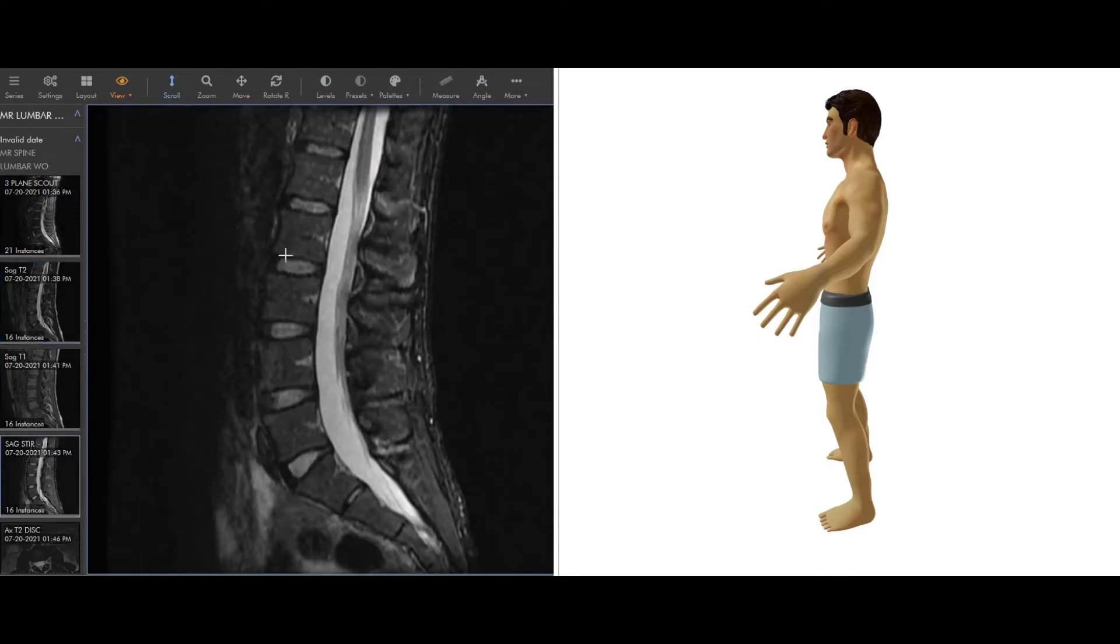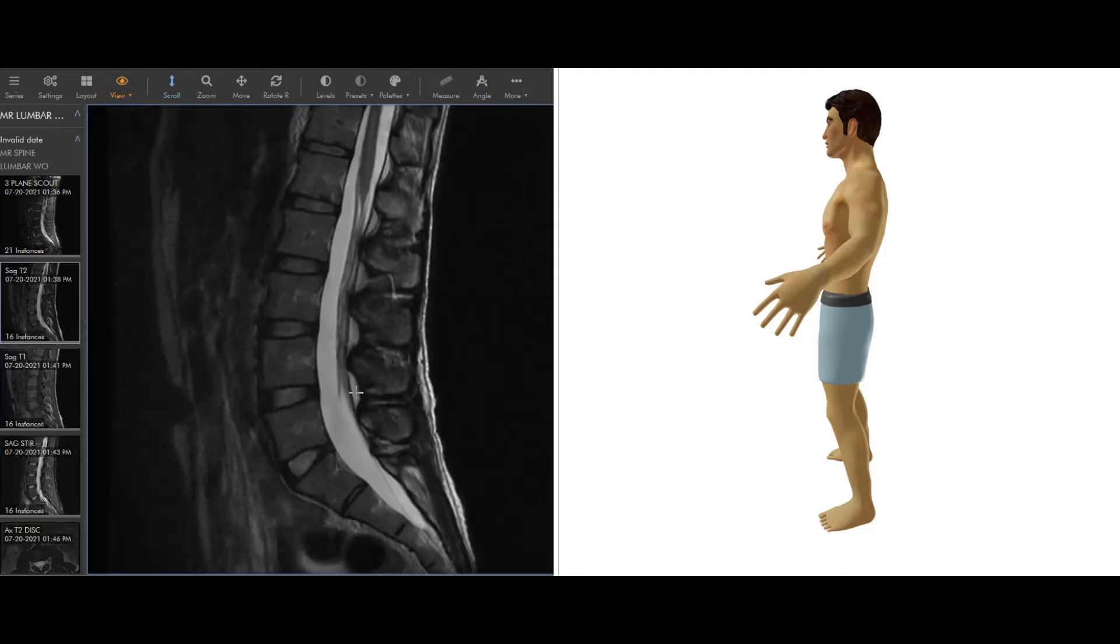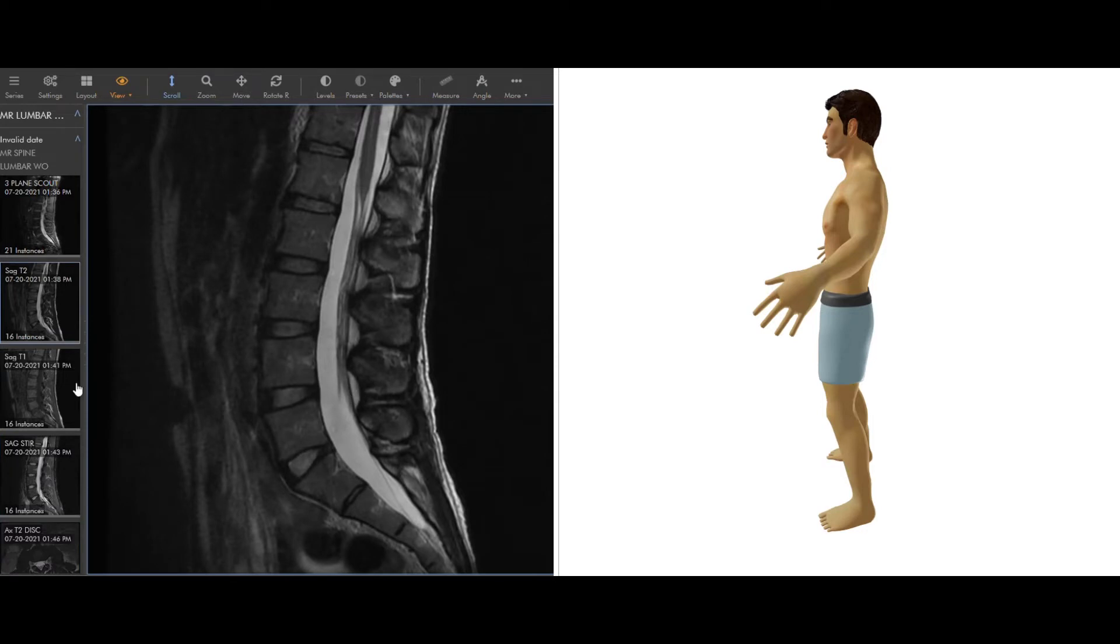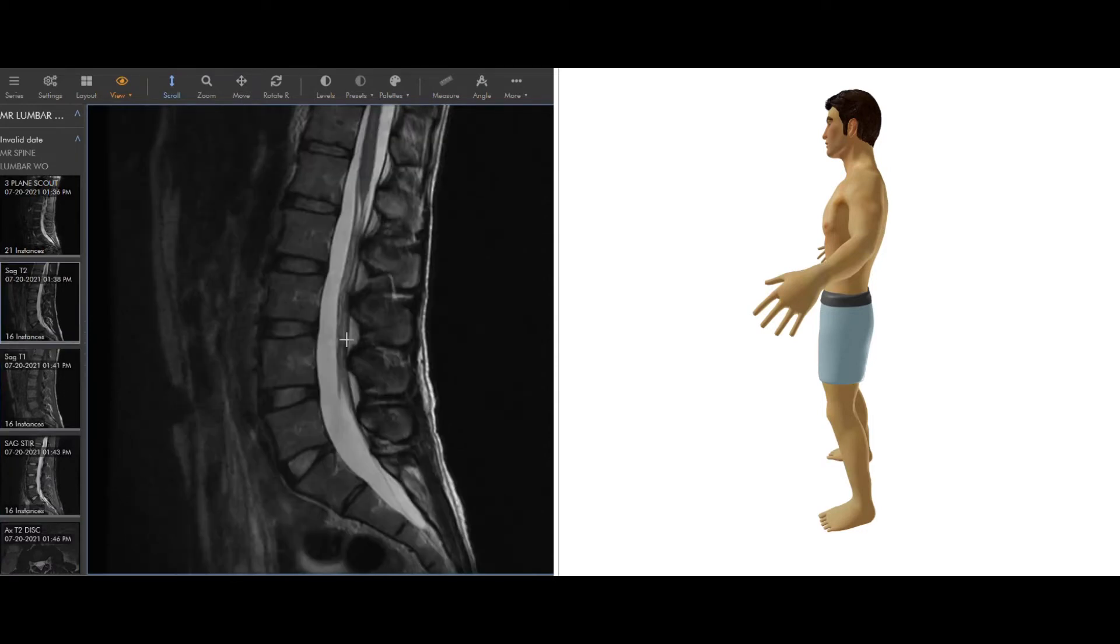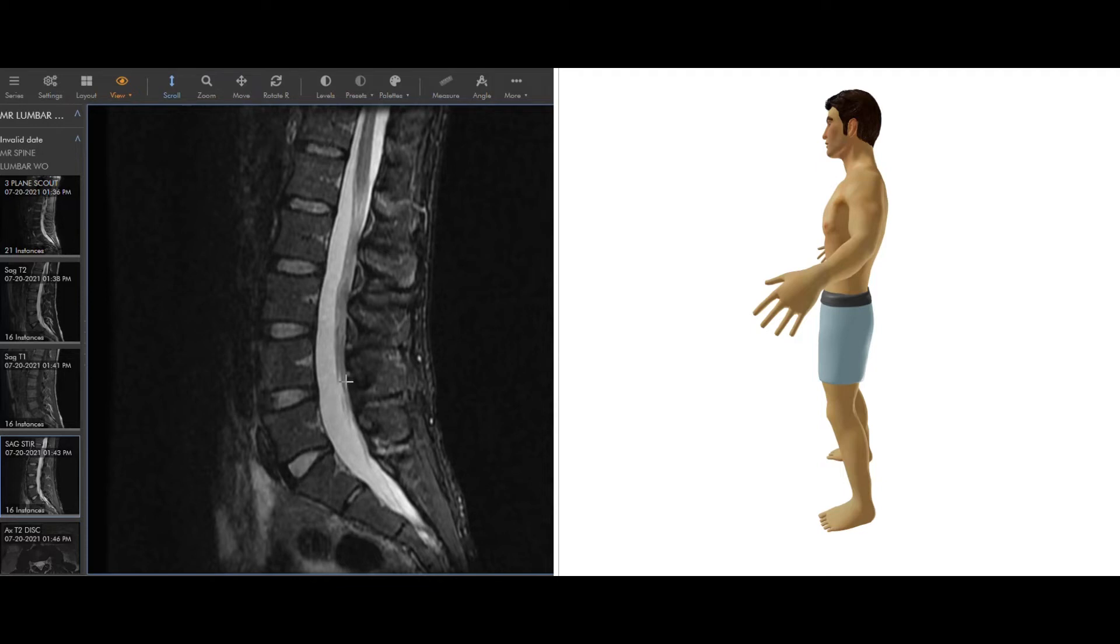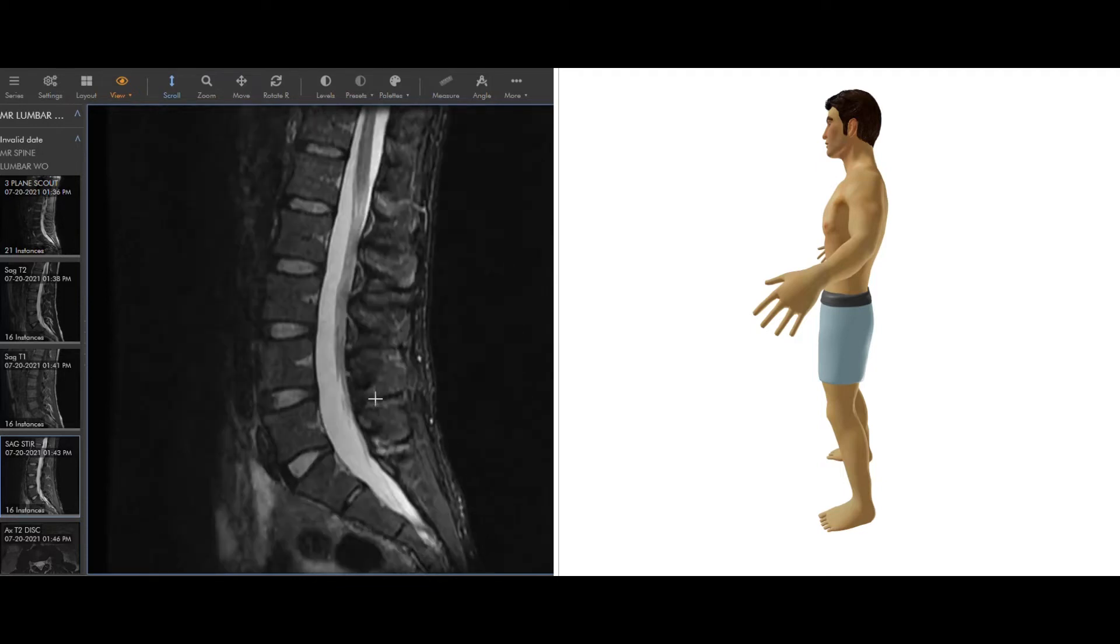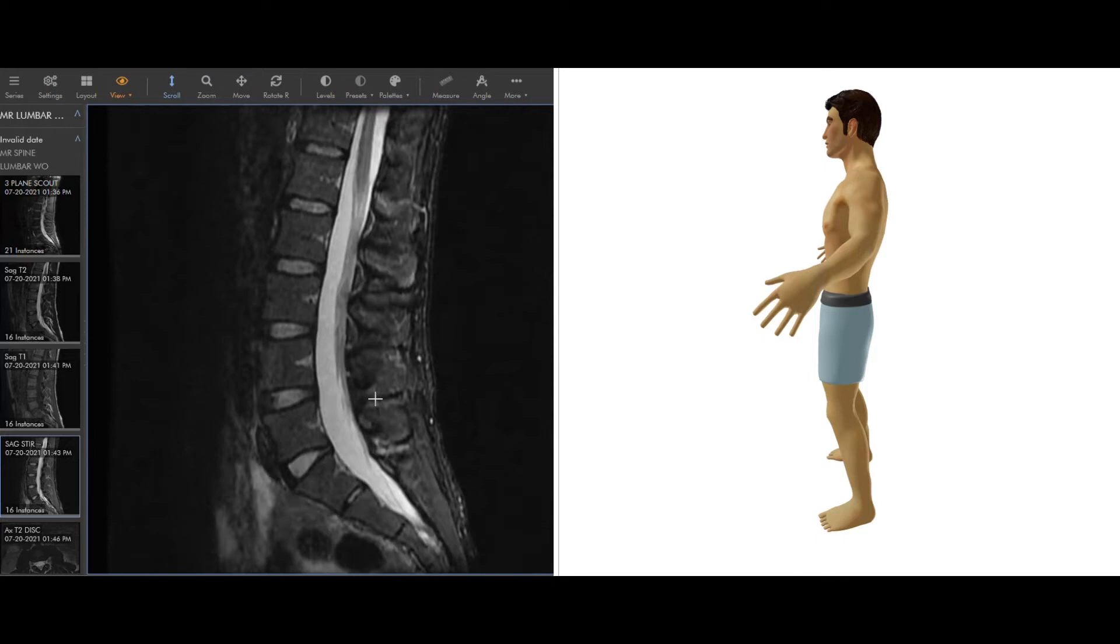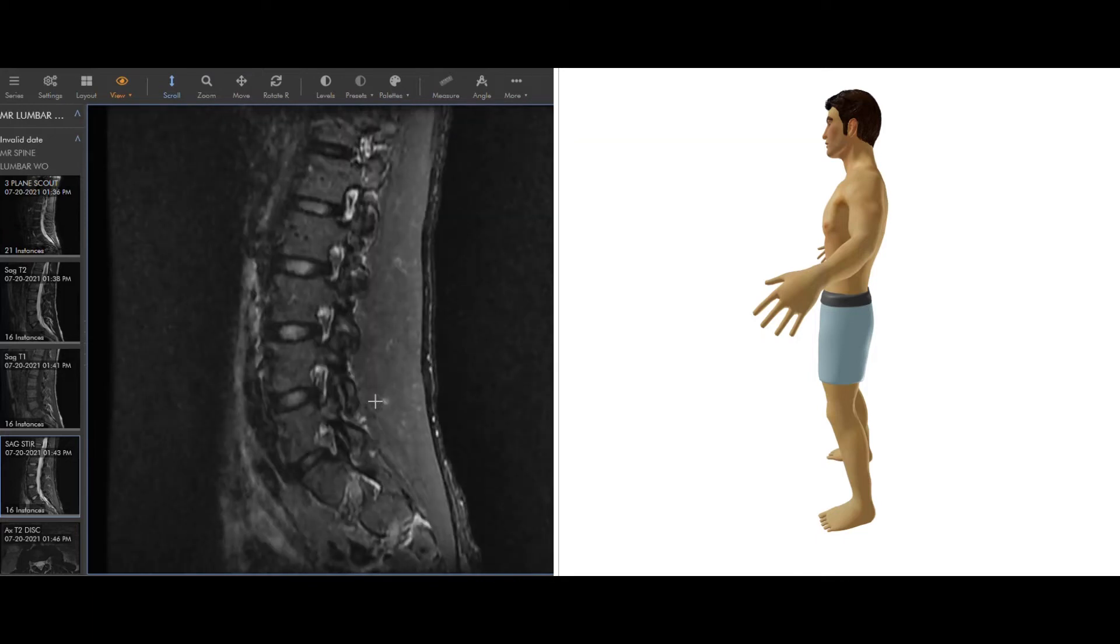This sequence here, this is called a STIR. It's not really important what it stands for, but basically it's a sequence that makes fat black. Back to this T2, you can see the fat is white here too, just like on the T1. So if we want to distinguish when something is not fat, we use a fat saturated sequence, meaning that we're nulling out the fat or basically making the fat black on purpose. So if there's something that's not fat in that area, it will not be blending in.